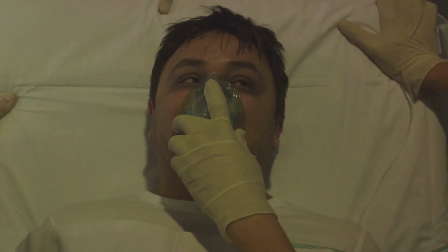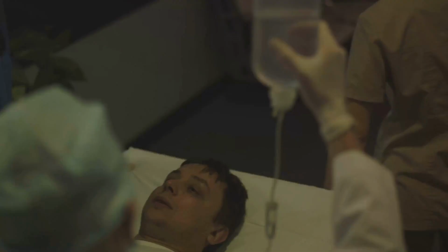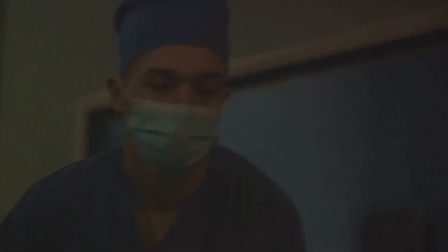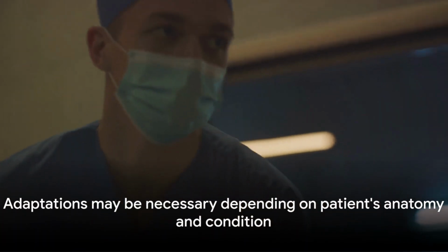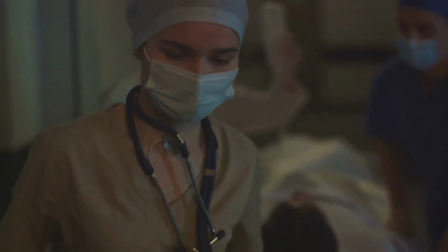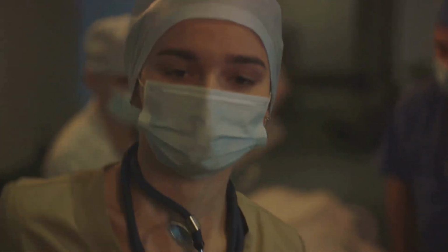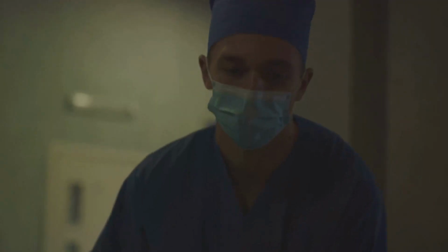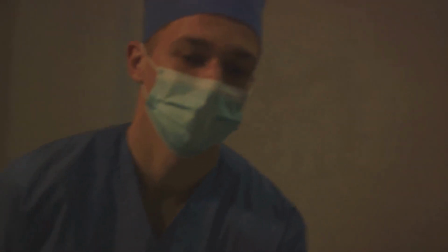In both methods, it's crucial to remember that patient comfort and safety are paramount. The procedures should be carried out gently to minimize discomfort and avoid injury to the nasal passages and larynx. And always remember to confirm the correct placement of the tube to ensure effective ventilation. Also, it's worth noting that while these are the general steps involved in nasotracheal intubation, every patient is unique, and adaptations may be necessary depending on the patient's anatomy and clinical condition. So that's the step-by-step process of how nasotracheal intubation is performed using both direct laryngoscopy and nasal fiber optic intubation.